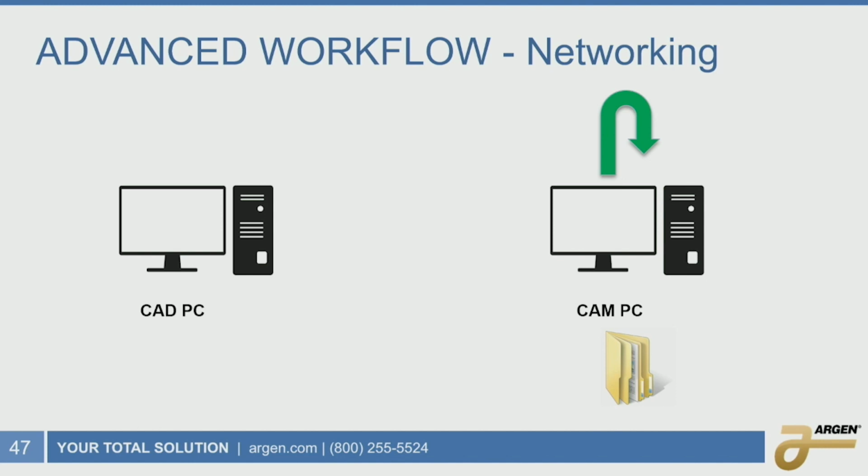The way I like to do my networking is where I put the host file on the CAM PC, and then when I have created my STL on my CAD PC, I transfer it via networking onto my CAM PC, so it actually lives on the CAM PC.